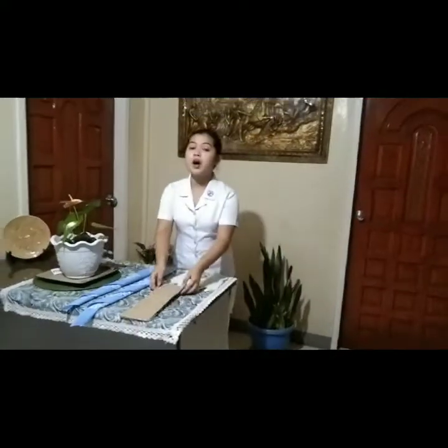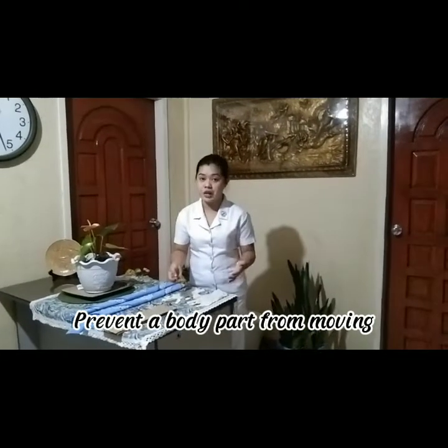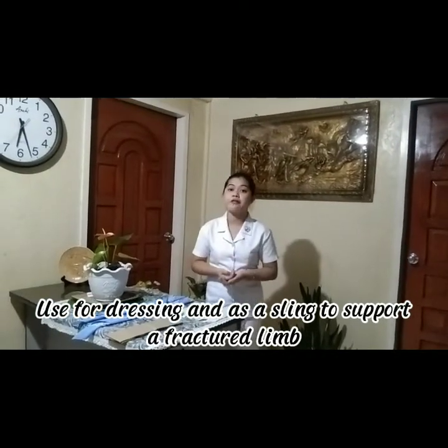The use of our rigid board is to prevent any body parts from moving. Our triangular bandages will serve as a dressing or a sling that will support the fractured limb.